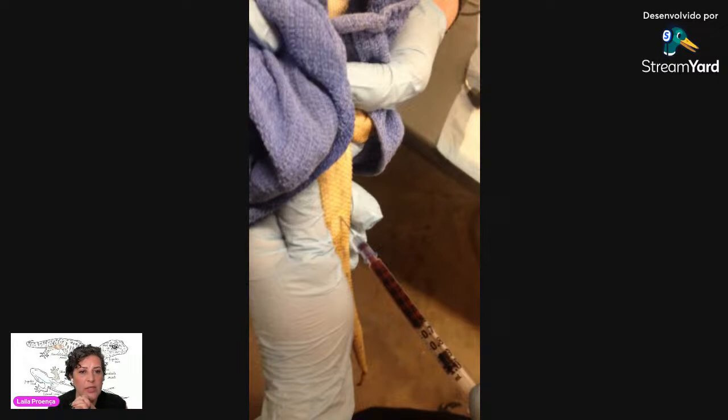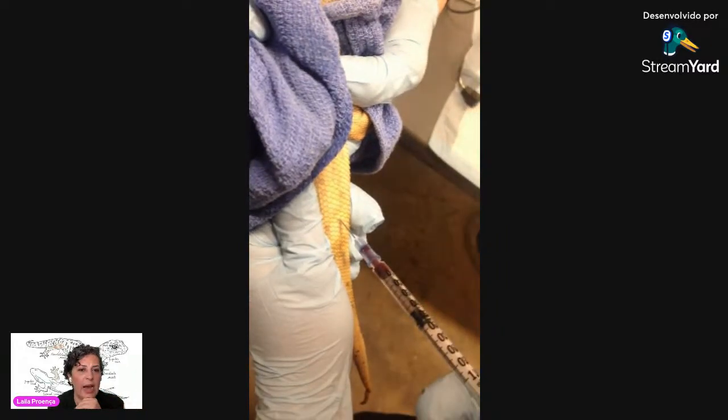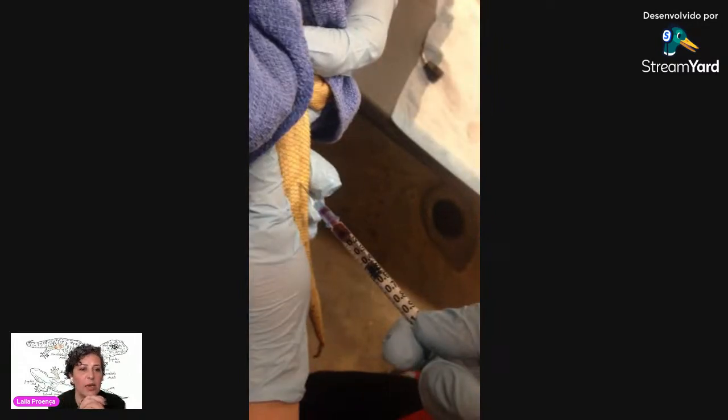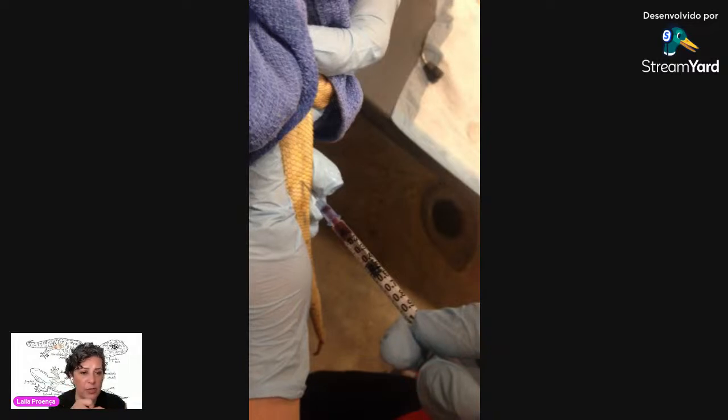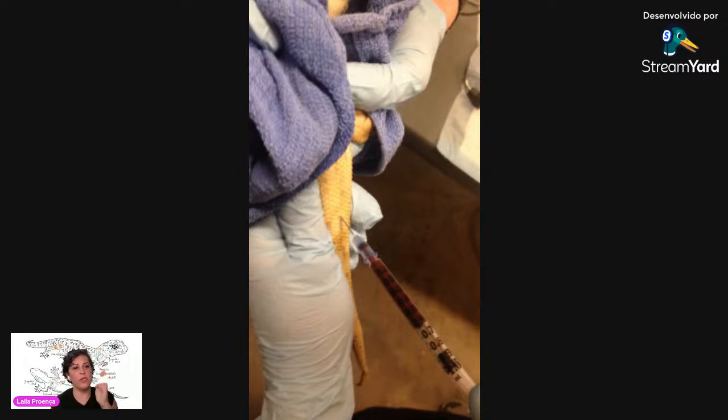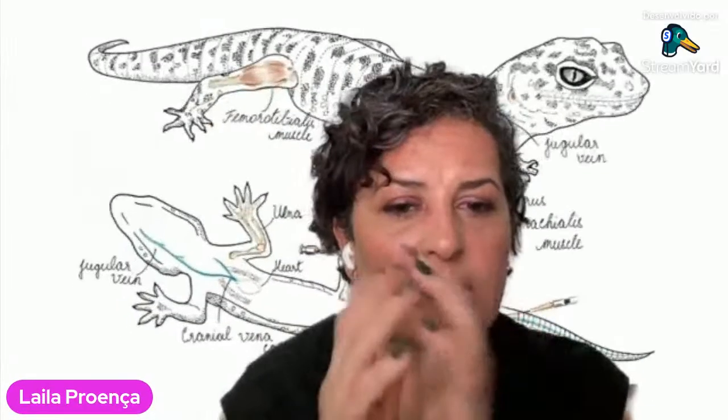Here, as you can see, I'm holding the tail with my hand, kind of scooping the tail so it doesn't move, and I am going right in the middle. You're going to insert your needle at about 30 to 40 degrees, sometimes a little bit more of a sharp angle, and go very slowly until you find resistance, or you hit the bone in the tail, the vertebrae. Then you're very gentle, and you bring your needle slightly back and collect your sample. As you can see here, I have the bearded dragon up because then gravity helps me, so the blood is going to the tail. So that's another thing that we can definitely do.